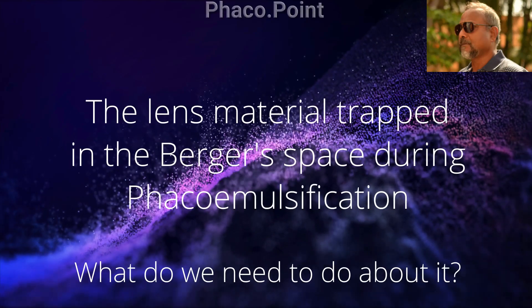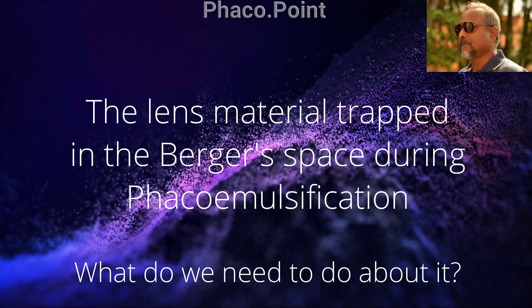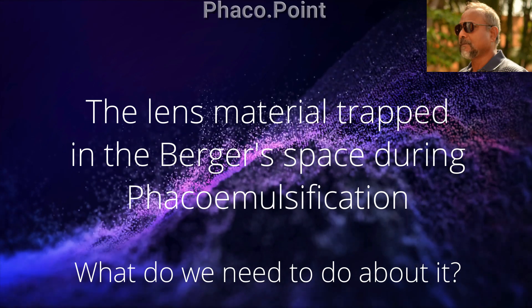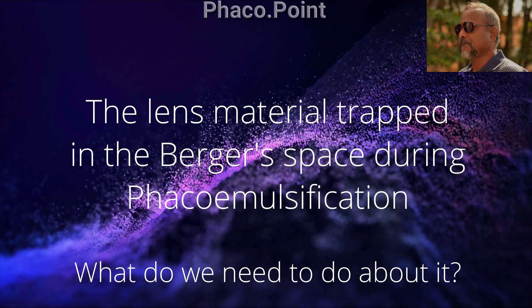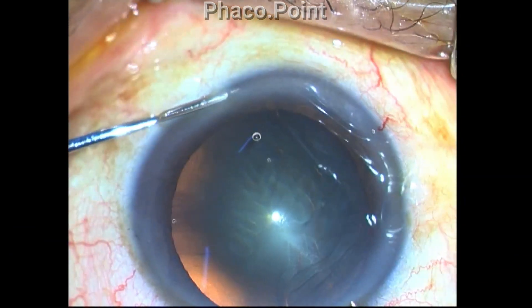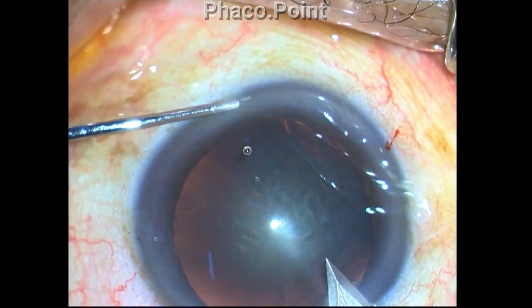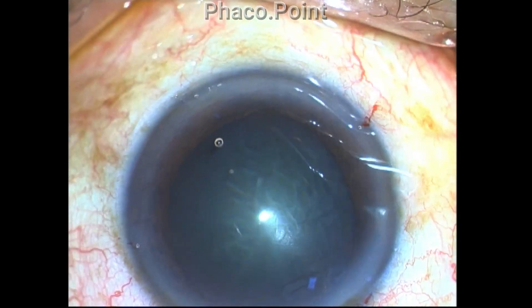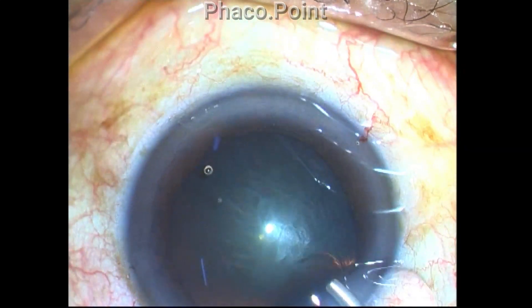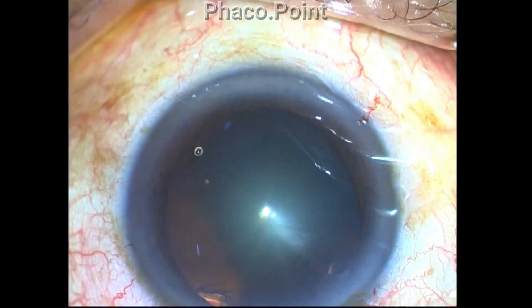Hello, my dear friends. In this video presentation I will touch upon how we need to go about managing a little bit of lens material that tends to get trapped in the Berger space during phaco emulsification. Let's look at the case from the very beginning. This was a 50-year-old male patient who was a journalist and a very good friend of mine for the last 10 years. He opted for phaco emulsification for a grade 2 nucleus cataract.